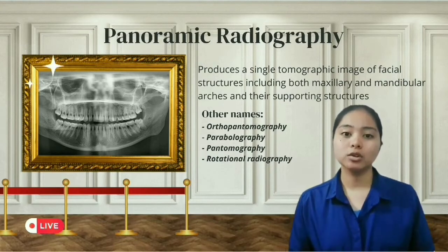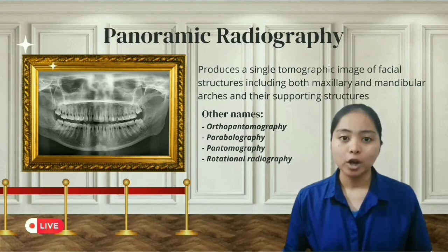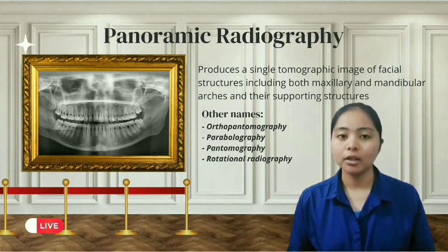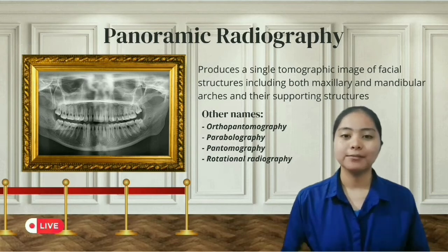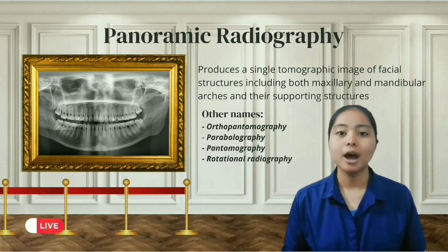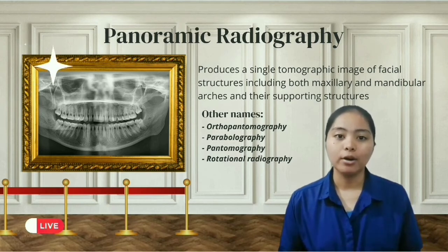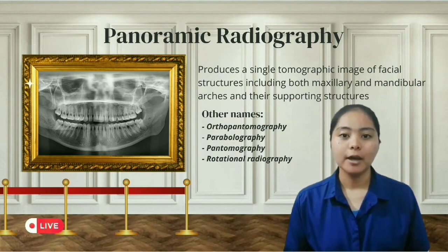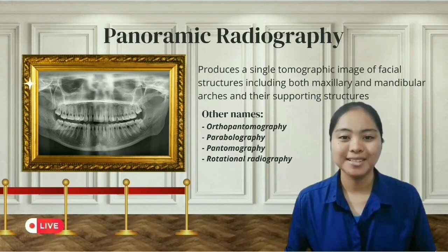This technique is also known as pantomography, pan meaning wide, tomo meaning slice, a cut or a section, and graph meaning to write. Aside from this, panoramic radiography is also termed as orthopantomography, parabolography, or rotational radiography. But before we dive deep, why don't we learn the history first, shall we?